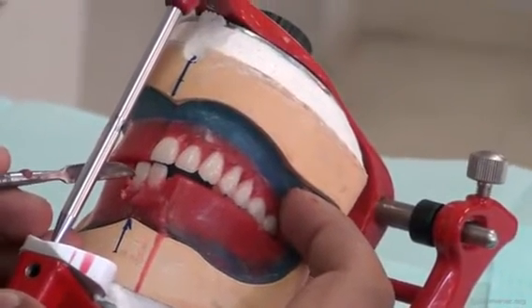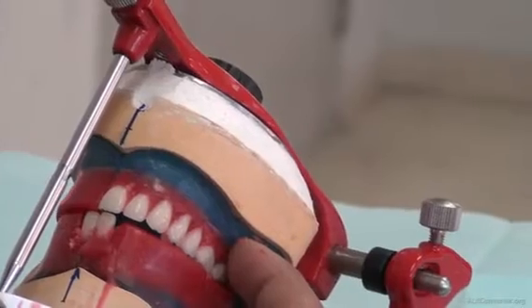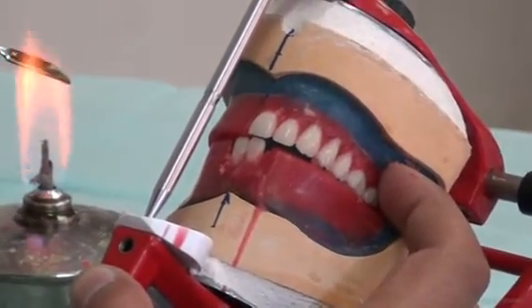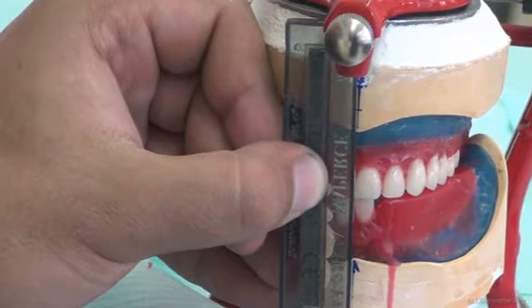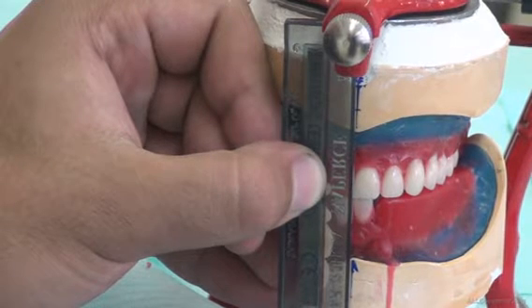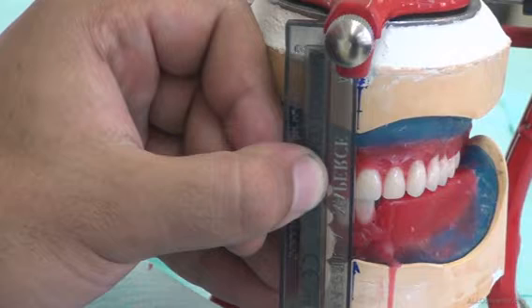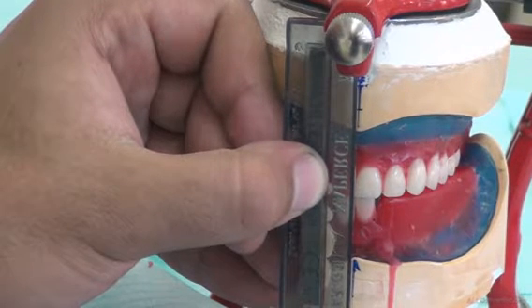Okay, this is how we adjust teeth in location. We simply move them while they are inside the wax. To make sure that the midlines are coinciding, we use a ruler in between, connecting the upper midline with the lower midline, and as you can see, the midlines are coinciding with each other. The upper central and the lower central are coinciding.